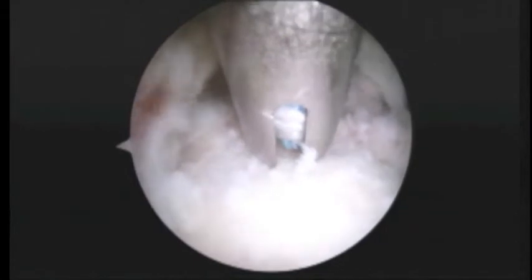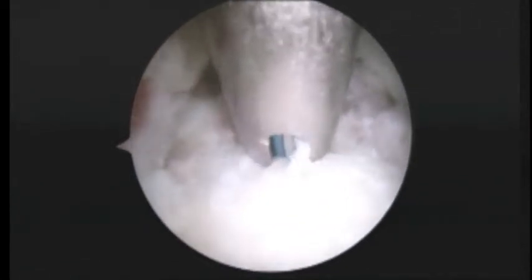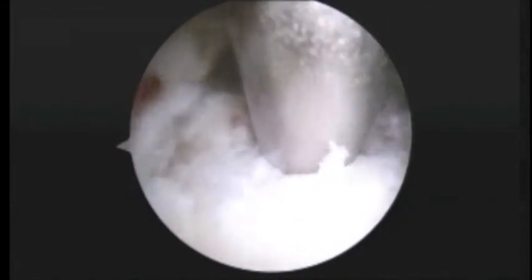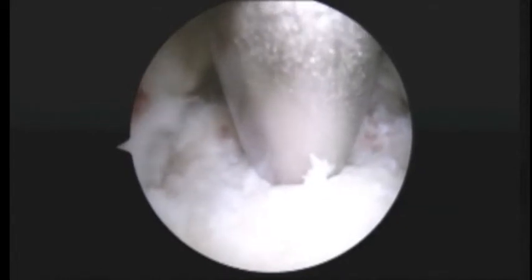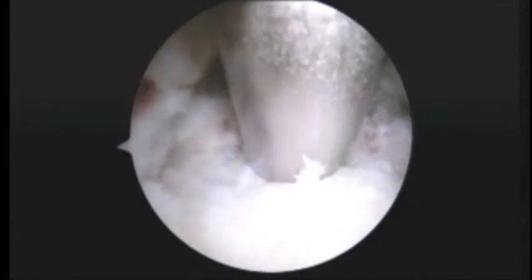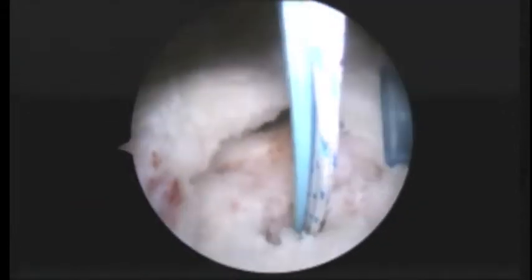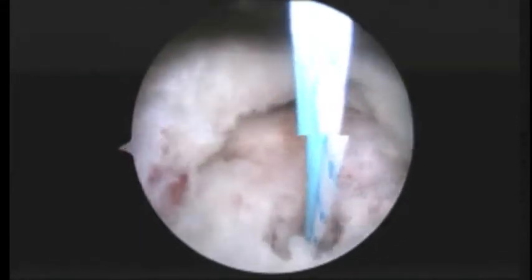Now this is a special anchor. It's an all suture anchor. It's got 3 separate sutures inside, so it's what we call triple loaded. Now we're going to seat the anchor by pulling back on the sutures. Make sure that's solid.